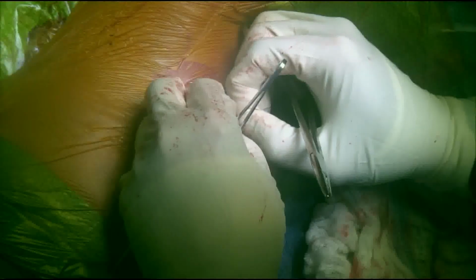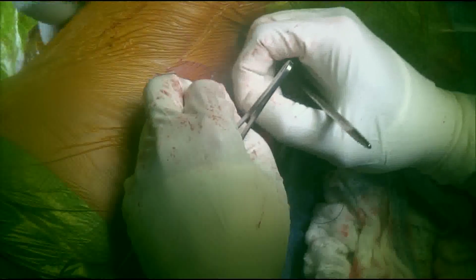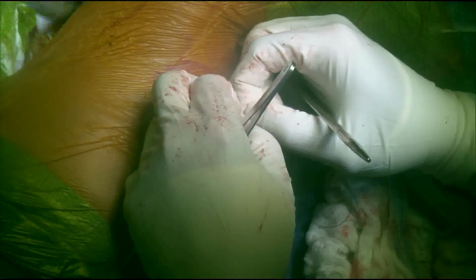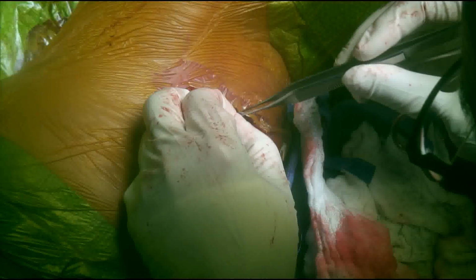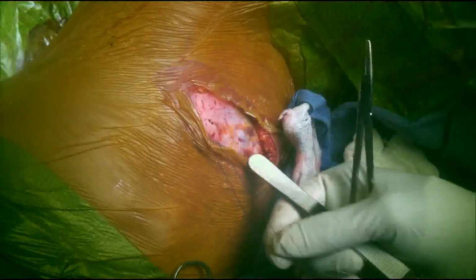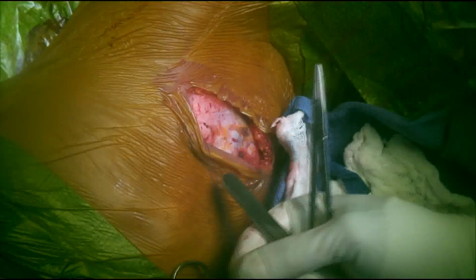This is in order to prevent rotation and also to decrease the pressure on the surrounding tissues. Care must be taken when preparing the anchoring sutures, especially if the muscle and the abdominal wall is quite thin, as the suture needle and the sutures can penetrate to deeper tissues.